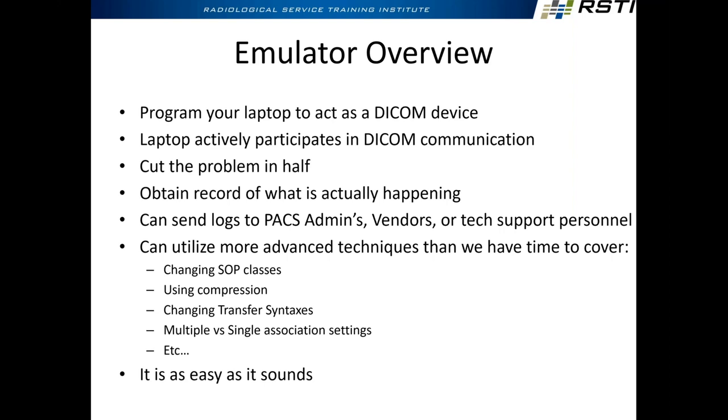We use sniffers as well, where a sniffer is a device that will listen to a communication and analyze these PDUs. The beauty of that is we're not involved in the communication at all. We can listen to it and sniff between them and analyze it. That's a whole other topic. You cut the problem in half. Check the SCU side, check the SCP side, check the logs as a whole. Obtain a record of what is actually happening. You can send the logs to PACS admins, vendors, tech support.